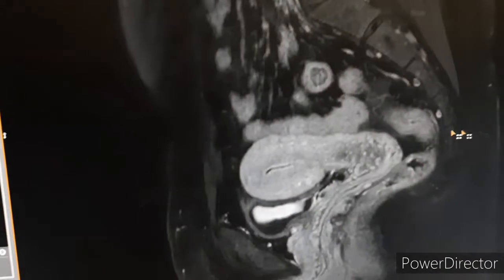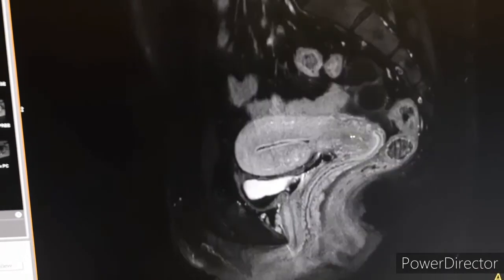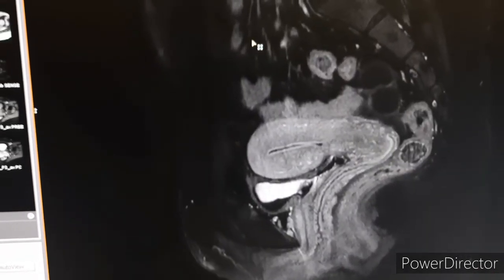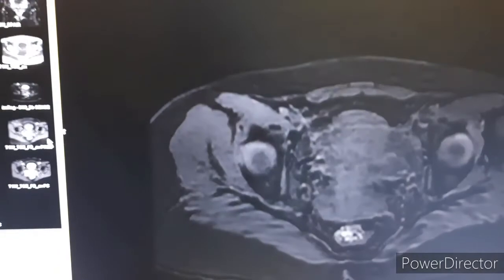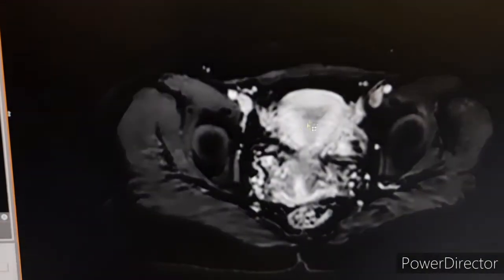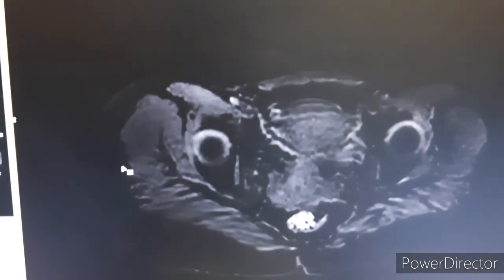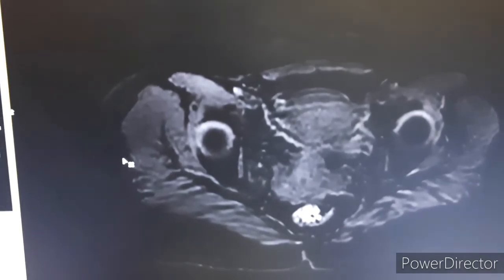Dynamic is very important. The plane for dynamics depends on the radiologist — basically sagittal or axial. Here you can see we have taken the dynamics in the axial plane. You can take up to 8 dynamics, in which the first is plain and the next 7 are dynamics — arterial and the rest are venous and washout phases.